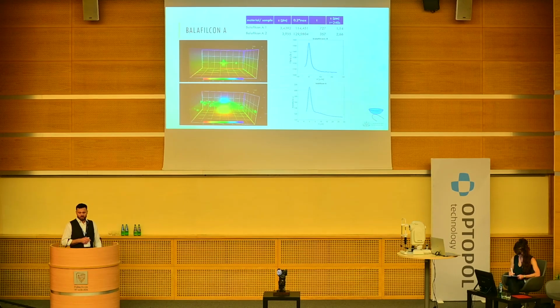Because we want to know how these lipids behave over time, penetrating or absorbing into the lens matrix. So looking at the table, Z is the information of where from, so maybe I will start with that. The peak is the place where we have the lens surface.